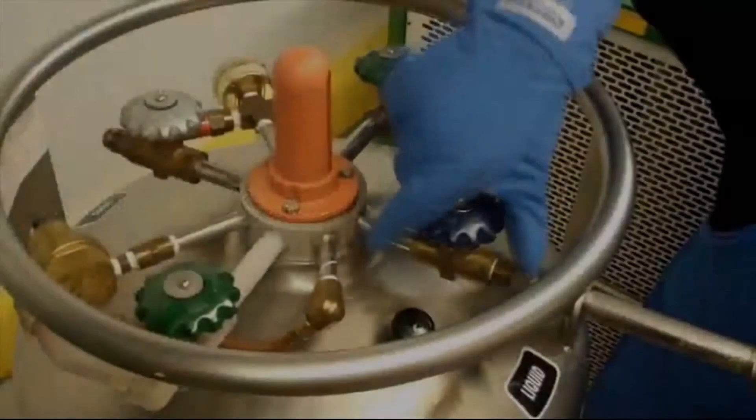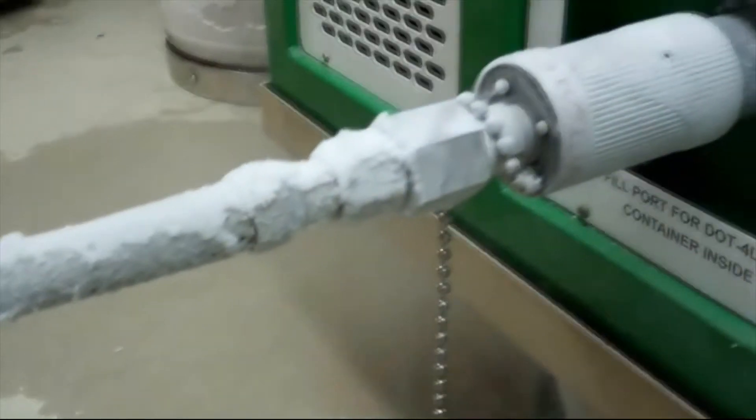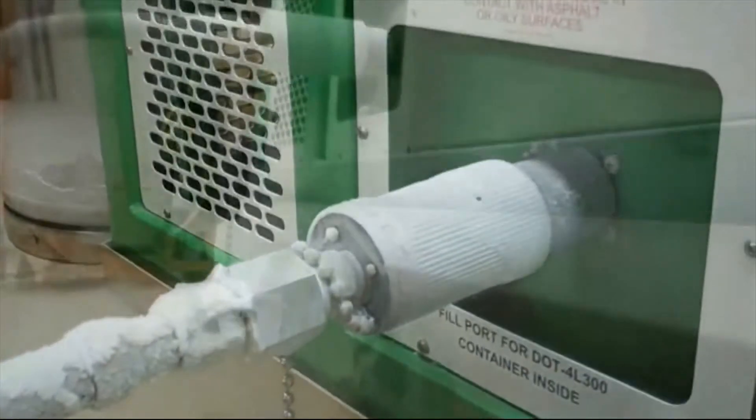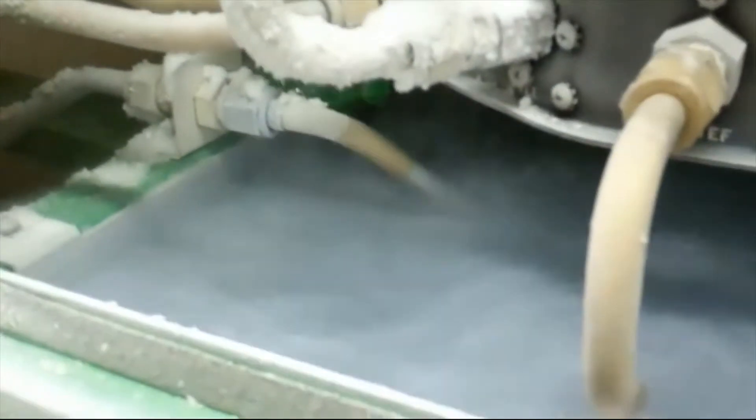Open the VGL's liquid valve. This begins the liquid transfer process from the VGL to the MODS. The MODS can take up to 60 minutes to become completely full. While filling the MODS, maintain a pressure of 30 to 50 psig by adjusting the pressure building valve on the VGL. Once a steady stream of liquid is coming out of the vent tube, the MODS is full.